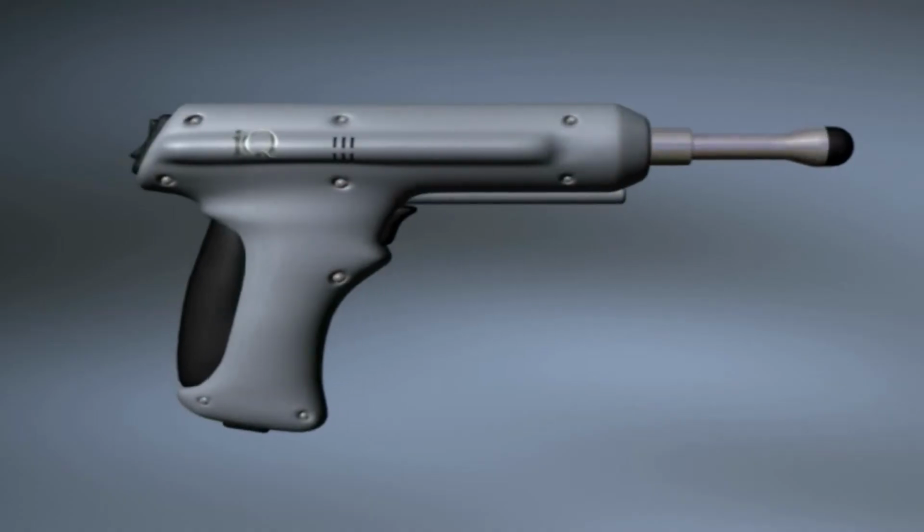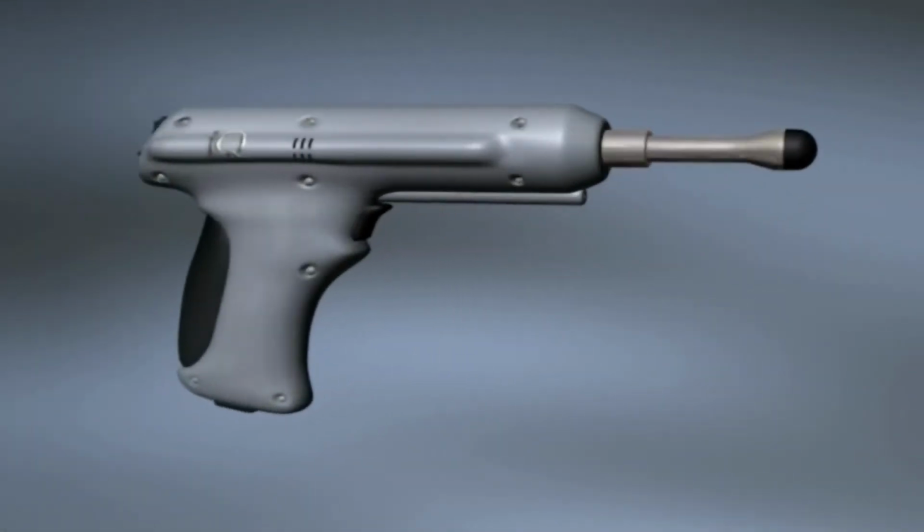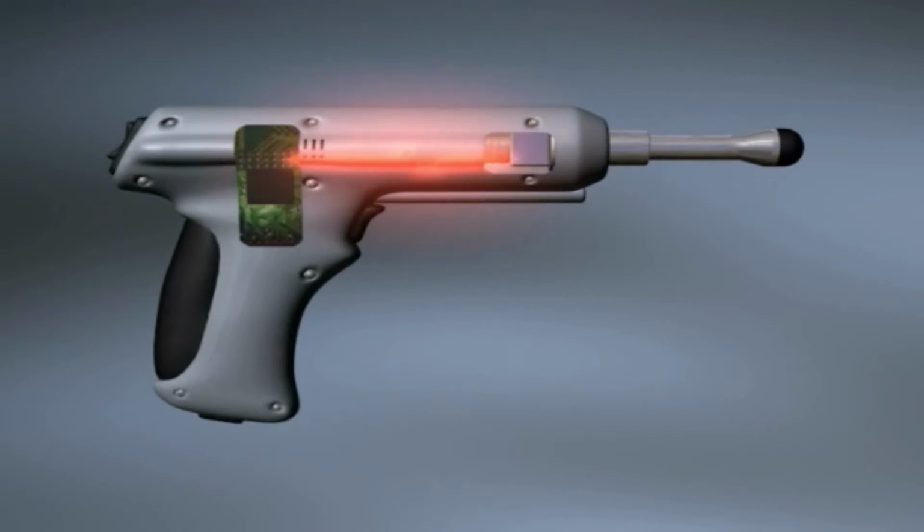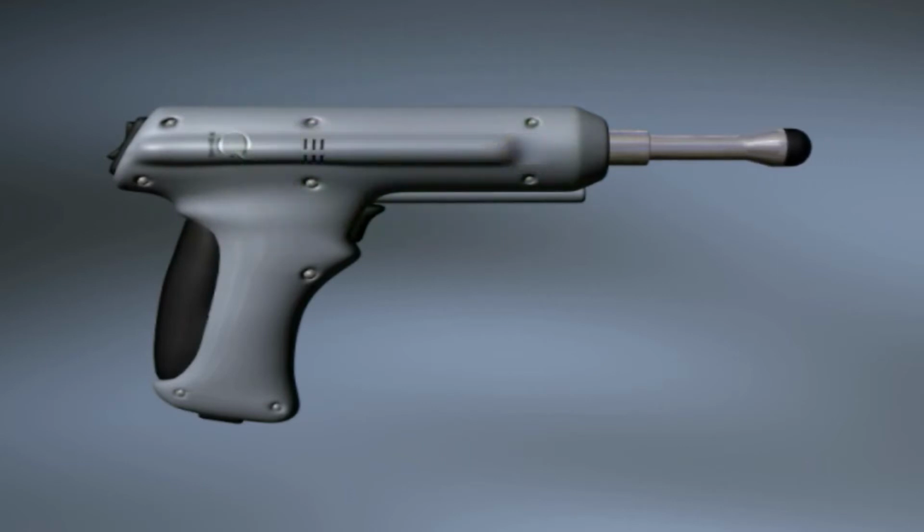So the motion of the bone is not disrupted. As I will show you briefly, when the bone moves, the instrument won't thrust until the bone is moving back in the appropriate direction again. So it's a very unique technology. In the front of the instrument, as you can see in the diagram, there is a sensor, and this sensor measures motion. The computer processing board in the handle identifies the information from the sensor and puts together an instruction to the instrument as far as the speed at which it will turn on and the depth, and it will alter depending on what the sensor delivers.